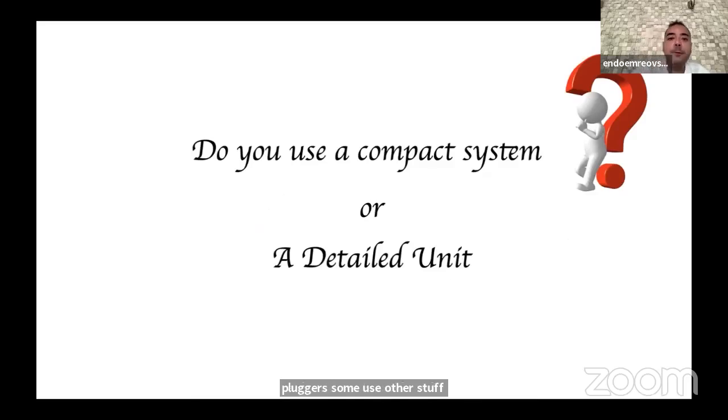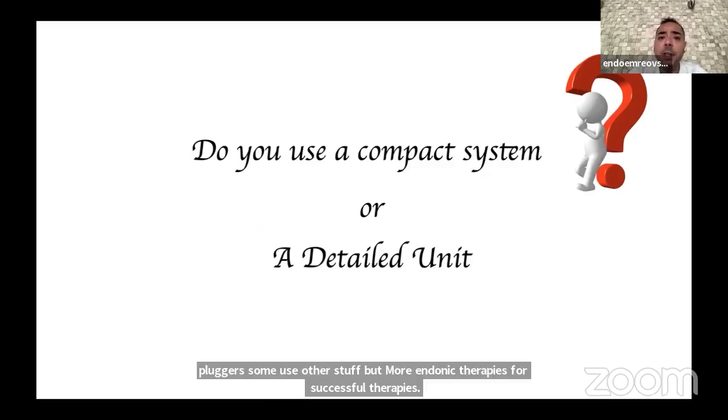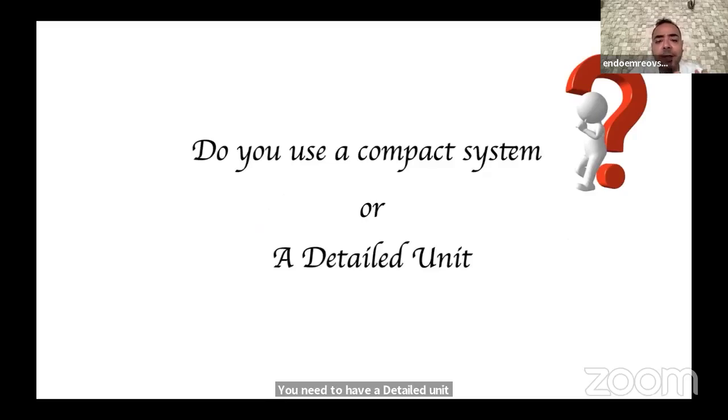But for endodontic therapies, for successful therapies, you need to have a detailed unit that includes everything and connects with each other, because basically it's an ecosystem like Apple devices or Microsoft devices. So all your tools need to be connected with each other to understand all details about your endodontic applications.